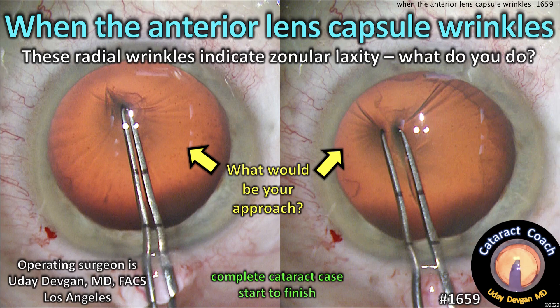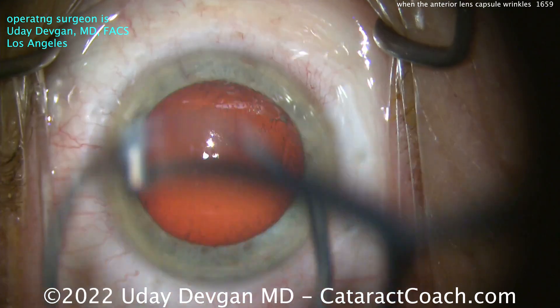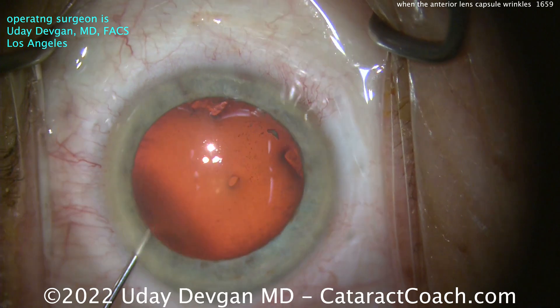CataractCoach.com. When the anterior lens capsule wrinkles, what do you do? You know what indicates some degree of zonular laxity. Let me show you this unedited routine case, start to finish. Complete cataract case here.